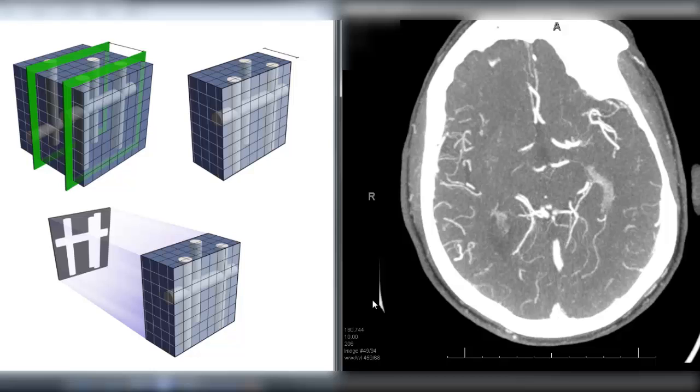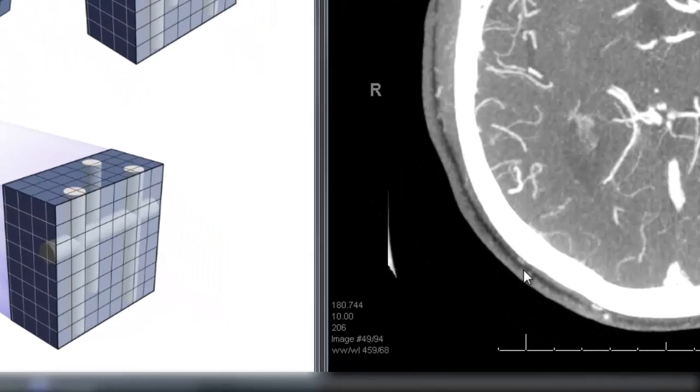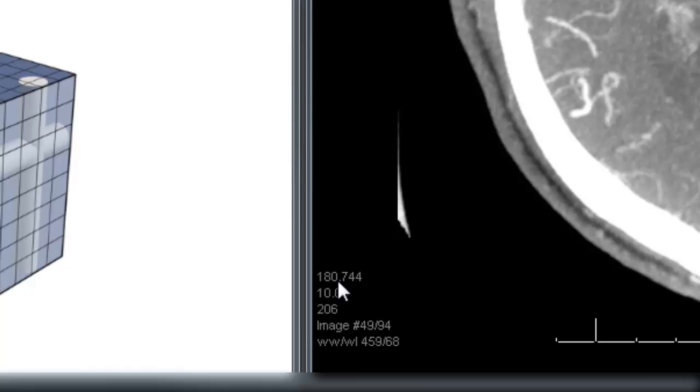What we can see is that we're not in this case moving this 10 millimeter thick slab by 10 millimeters each time. Instead we're moving the center of it a smaller amount and that smaller amount can vary according to the protocol that's used.